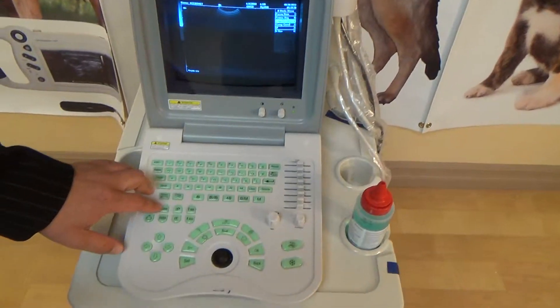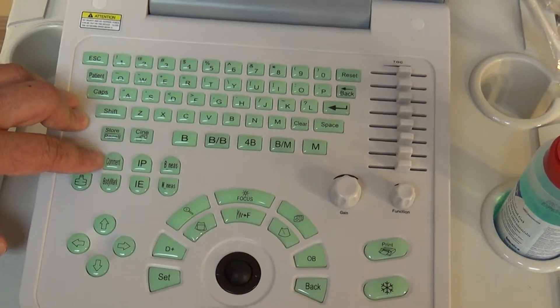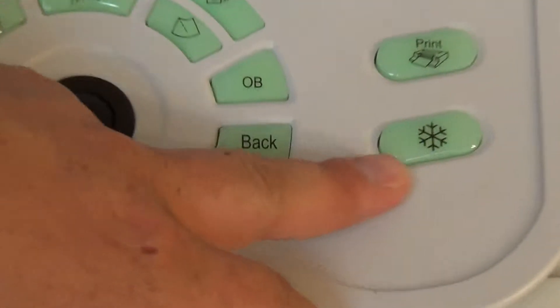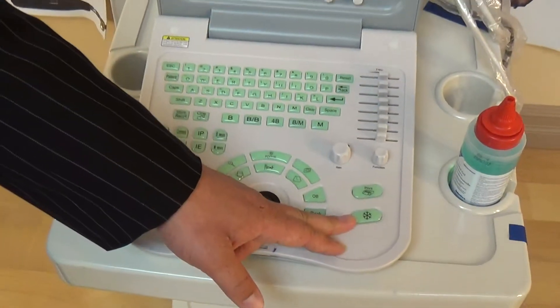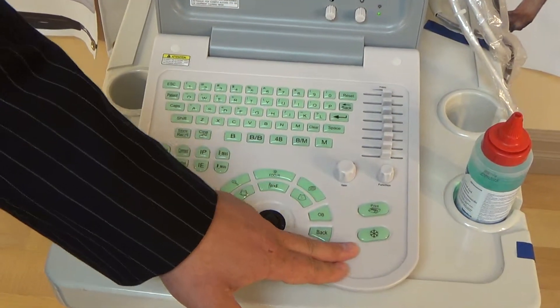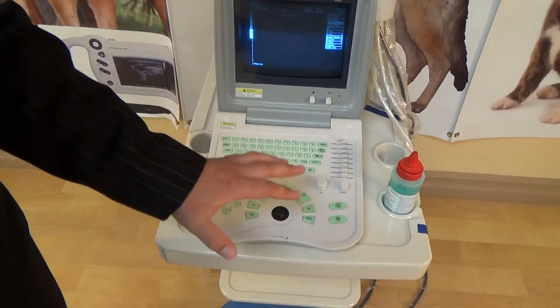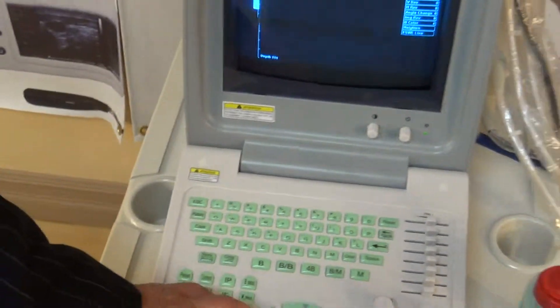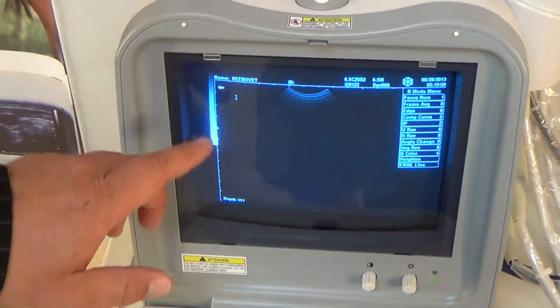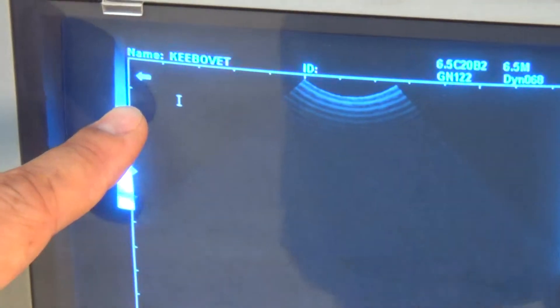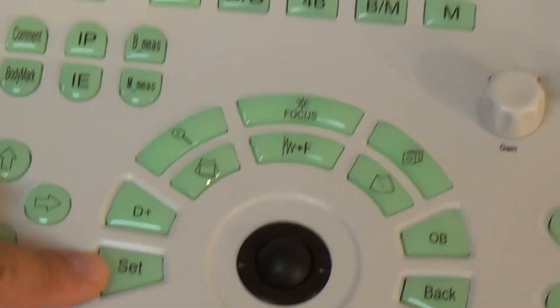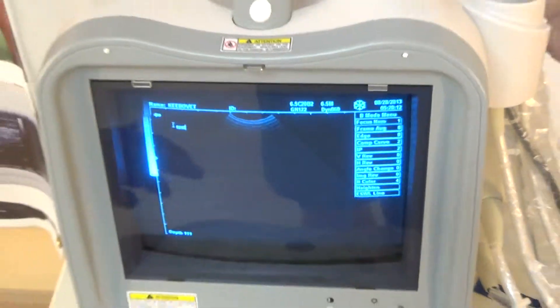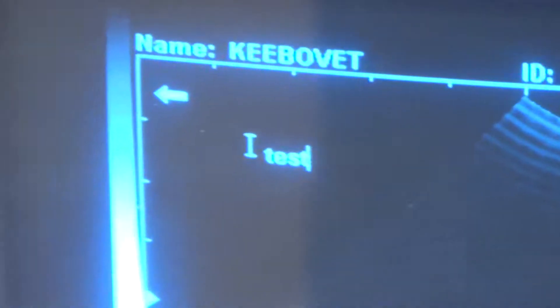Moving along, the next button that's probably going to be used by a lot of people is the Comment button. In order to place a comment on the image, the first thing you need to do is hit the freeze button — the snowflake. That's a standard image ultrasound machines use to freeze the obtained image. You always hit that first, then hit your Comment button. A cursor will come up, and all you have to do is hit Set and begin typing whatever text you want.